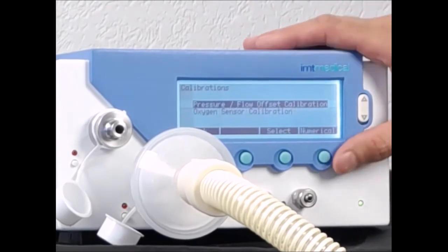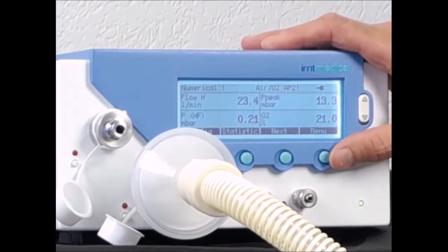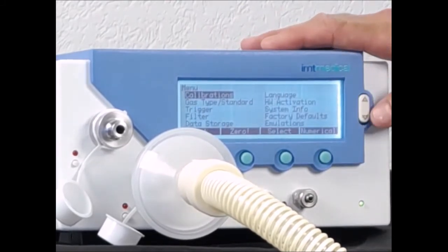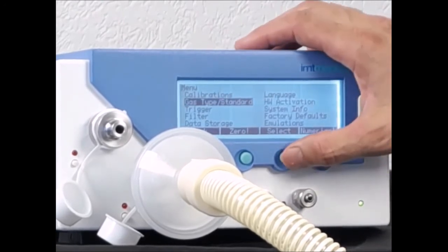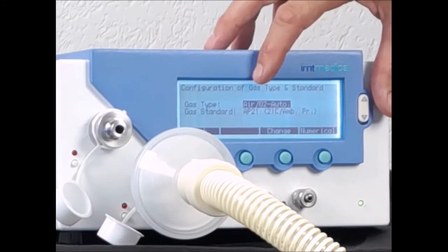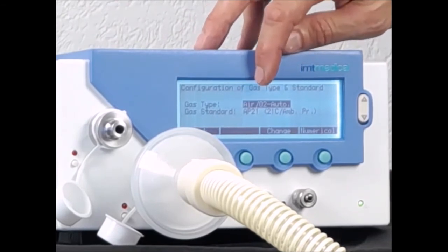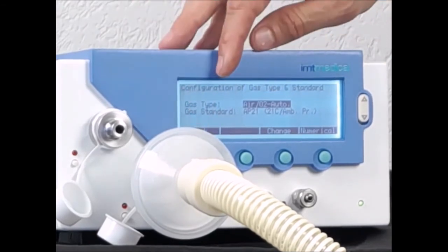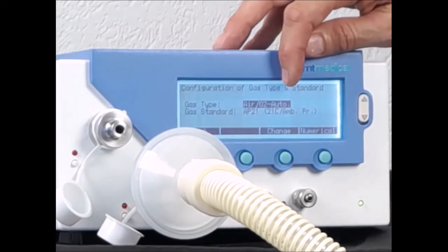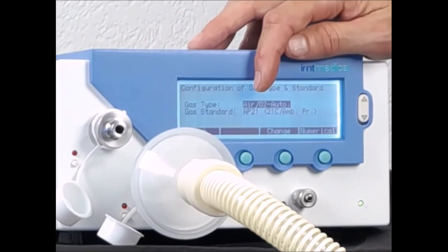As a next step, we should always double-check that the gas type, gas standard, and trigger settings match what we are doing. I go to the menu, go to gas type and gas standard, and select it. My gas type is air and oxygen automatic, meaning the oxygen cell measurement is automatically used to detect what kind of air-oxygen mix is being measured. That's a typical setting for ventilators and anesthesia machines. The gas standard is AP21, which is used for the Bella Vista ventilator. Any other ventilator may have a different gas standard — the only way to know is by reading the service manual of the ventilator or anesthesia machine.